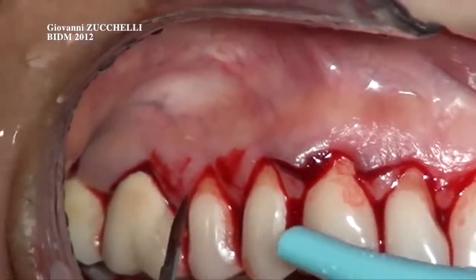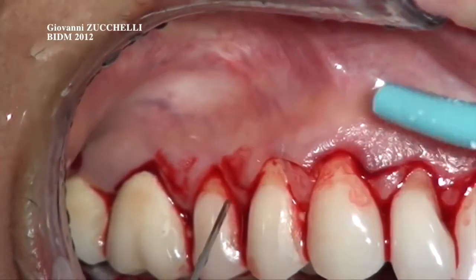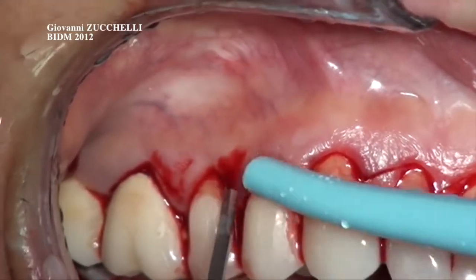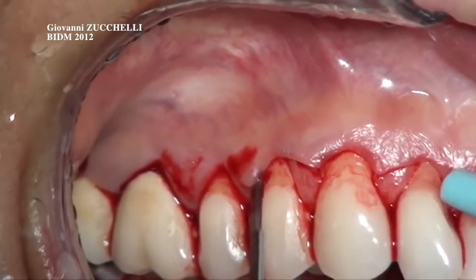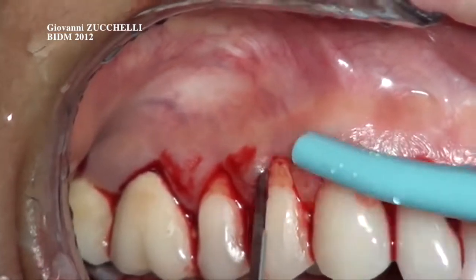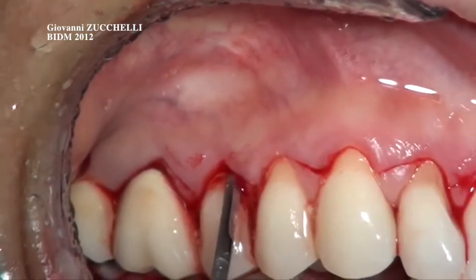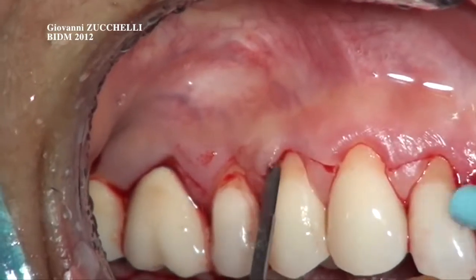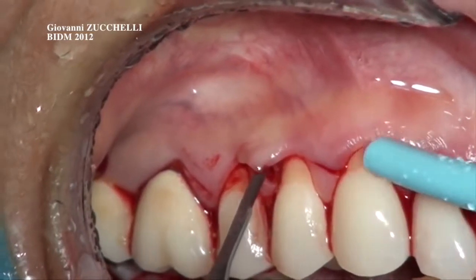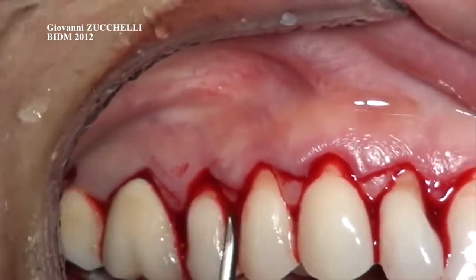Now we go to the 4. Come here, follow the incision line, open the tip of the papilla. Now the tip is above my knife. May I have some saline, please? Okay, that's enough. Again, the surgical papilla is that area connecting the probable area of the two adjacent gingival recessions.